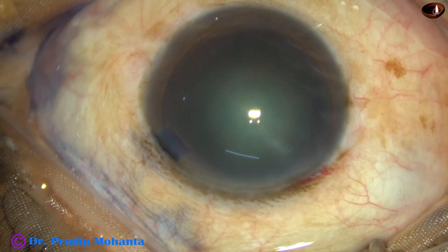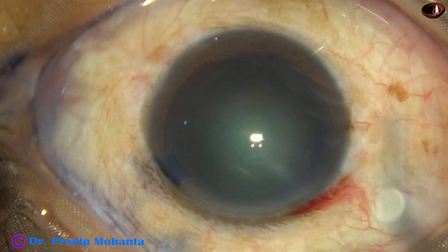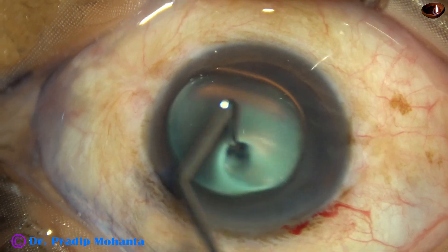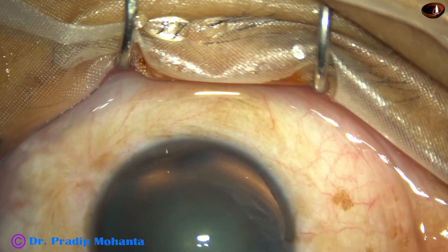And now, the anterior chamber is filled up with visco. This is 2% hydroxypropylmethylcellulose. Visco is also applied over the corneal epithelium for better visibility.